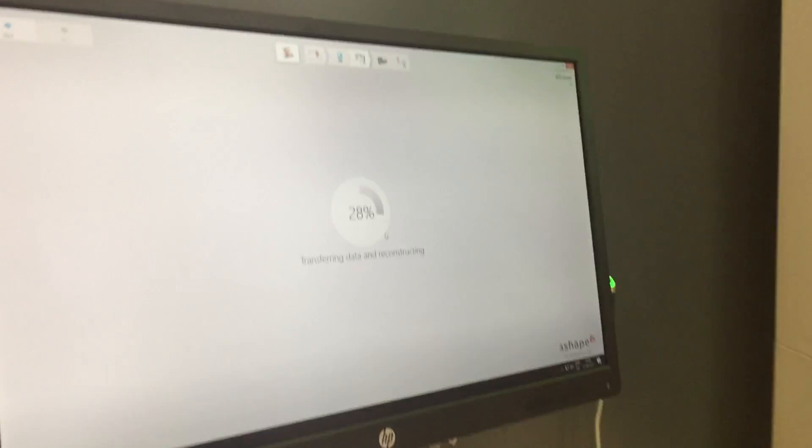So now it's just transferring the data. And afterwards we can practice. So that will take a while.